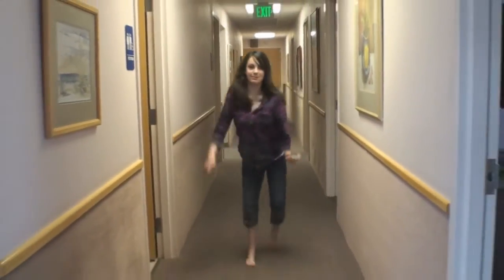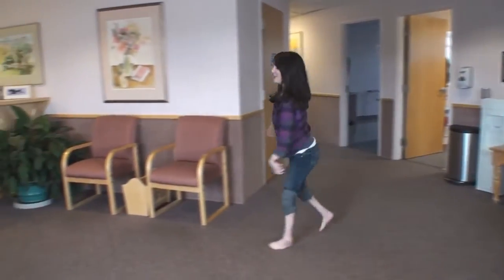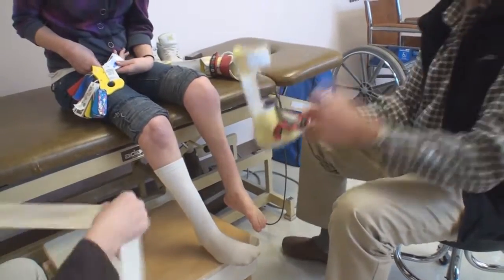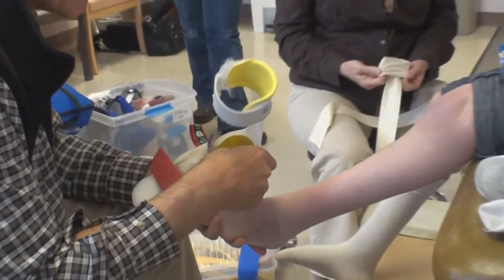And that would take into account walking, observing, manipulating, etc. That's a very important part of getting a brace made for you — that's where the planning comes up with an idea that, in theory, will help you walk or benefit the most from it.